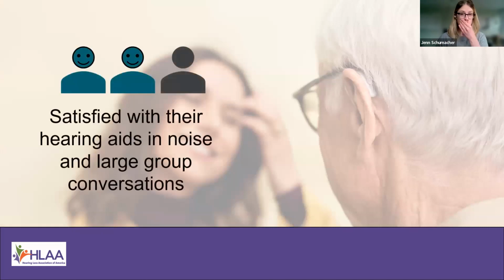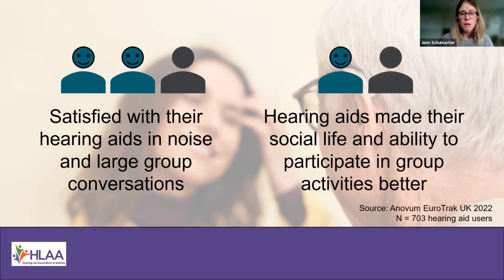And even though it's not perfect, for the most part people who wear hearing aids feel pretty satisfied with them. This is a survey that goes out every few years, and this one was done in the UK, with over 700 hearing aid users. These are people who have worn hearing aids and are at least somewhat used to them at this point. And 2 out of 3 people on this survey said they're satisfied, somewhat satisfied to very satisfied, with the way their hearing aids help in noise and in large group conversations. Those are probably 2 of the toughest situations you can encounter.